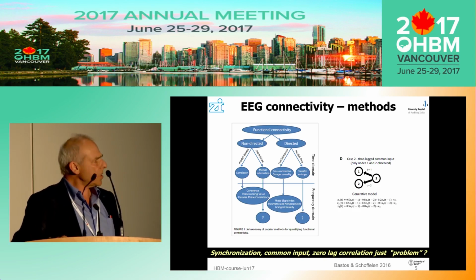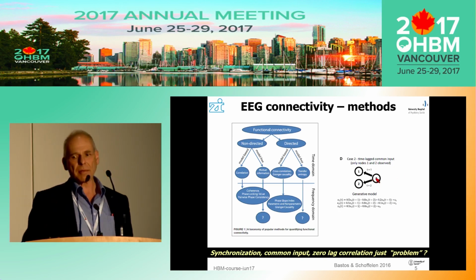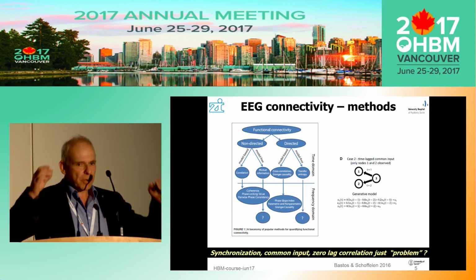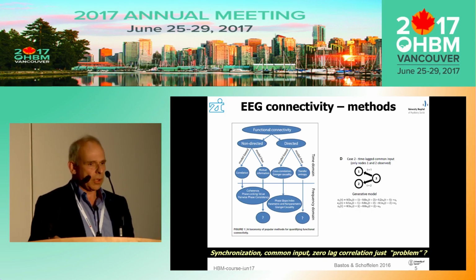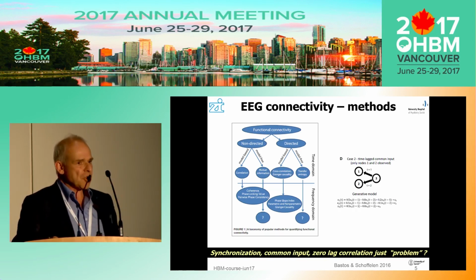Now, I think the important thing is to consider that this is a very typical situation in ERP research, because you very often have situations where you, for example, observe activity in the two hemispheres with a common input, with a region controlling or modulating both activity patterns, and this is not observable, or less well observable, than cortical superficial activity. And this is just a reality of what we're observing.